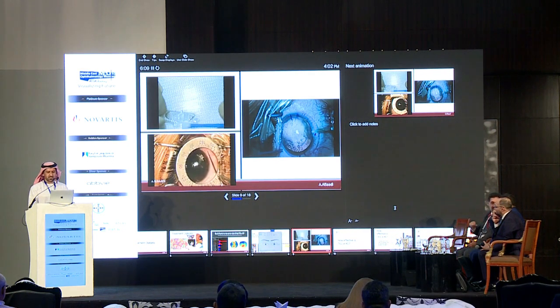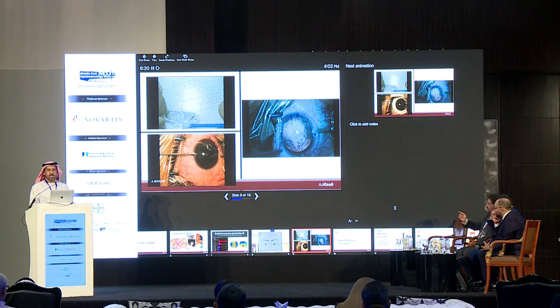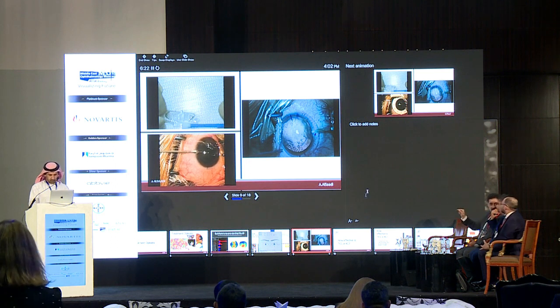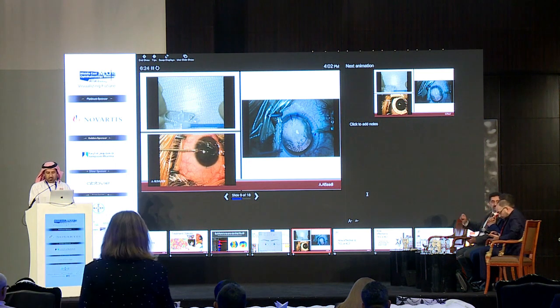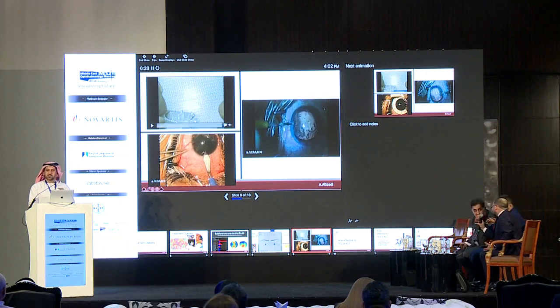Here is the introduction. All I need to say is that in keratoconus, the most important two things to do are the direction of your wound, and don't overfill when you inject, and keep the pressure on your lens while it's going in, so it does not flip.